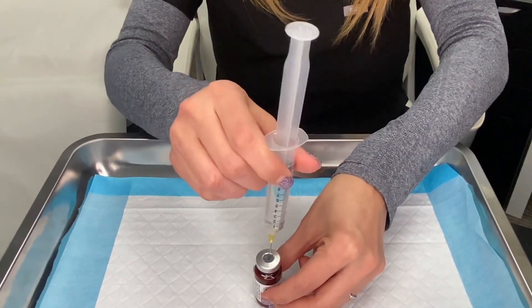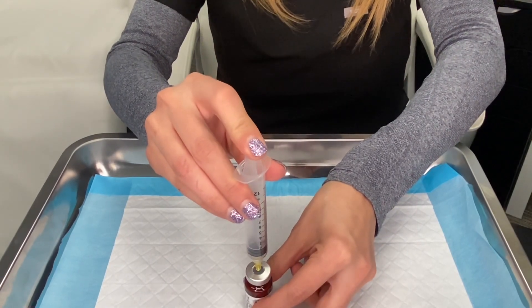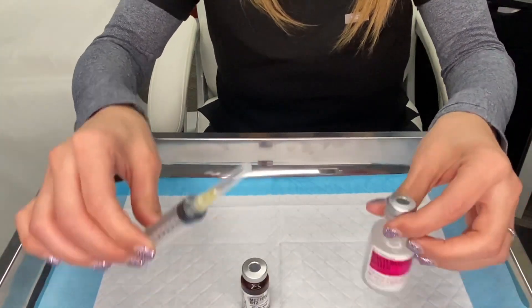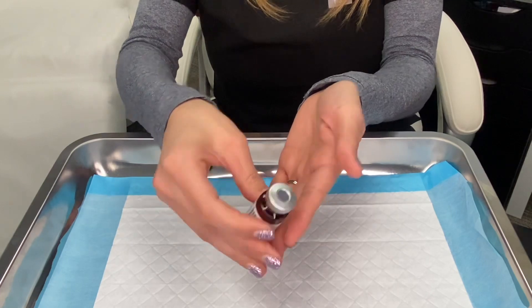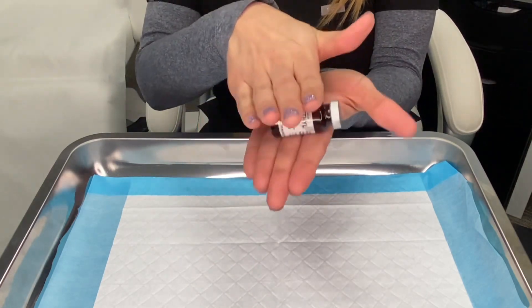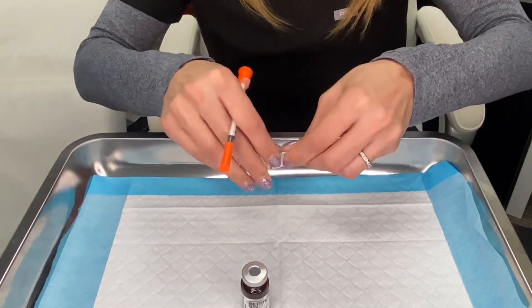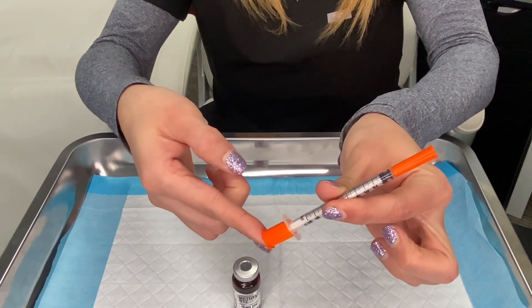Next, you're going to add the sterile water to the vitamin B12 vial. This will only be done once. When you're done, you no longer need your mixing syringe or your bottle of sterile water. Then you can roll the vial of B12 between your hands to mix it.